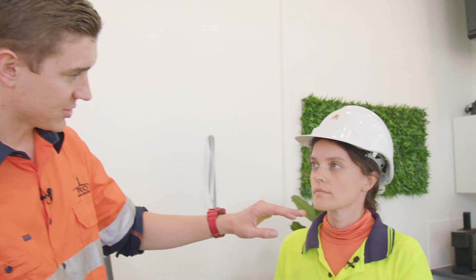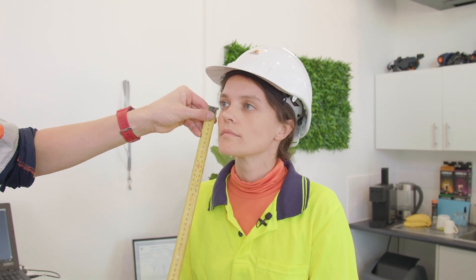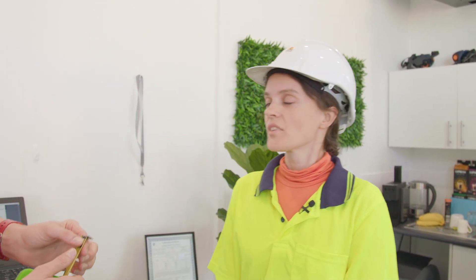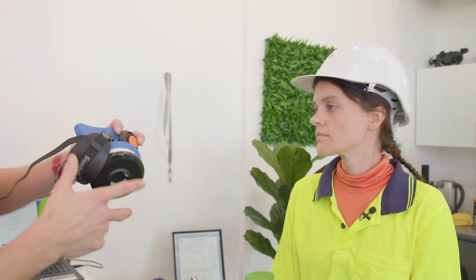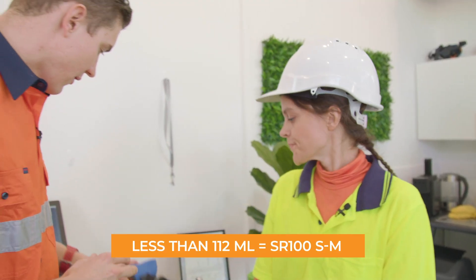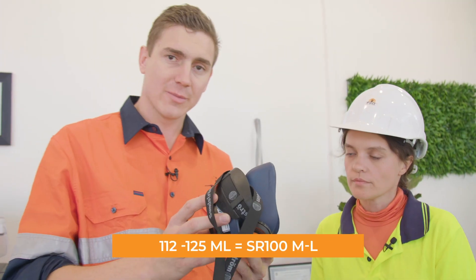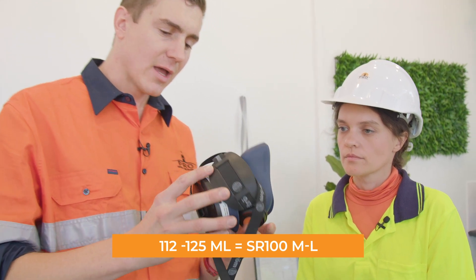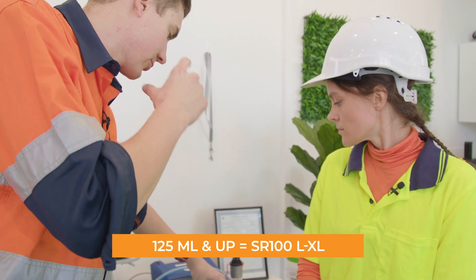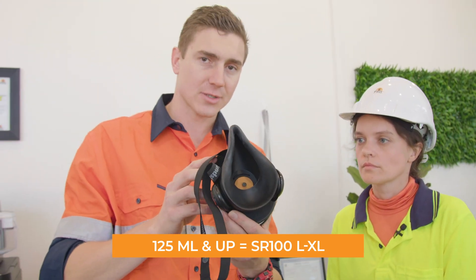What we're going to do with Yulia is measure from her eye to the bottom of the chin. From eye to chin she's measuring 100 millimeters. Sunstrom recommend for a face that's small or less than 112 millimeters they recommend the small medium. For a chin to eye measurement of 112 to 125 millimeters they recommend the medium large, and for anyone with a face larger than 125mm they recommend a large extra large.